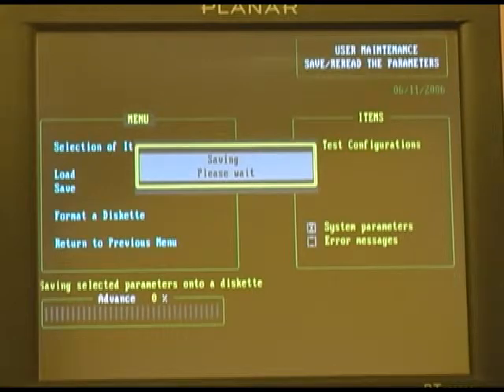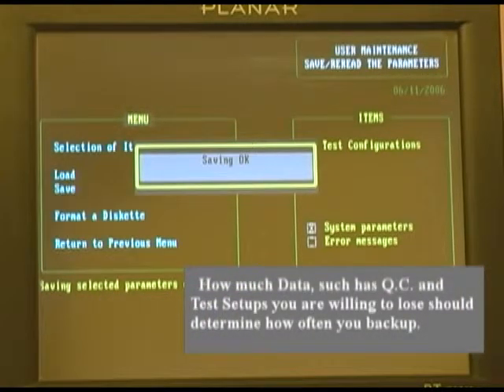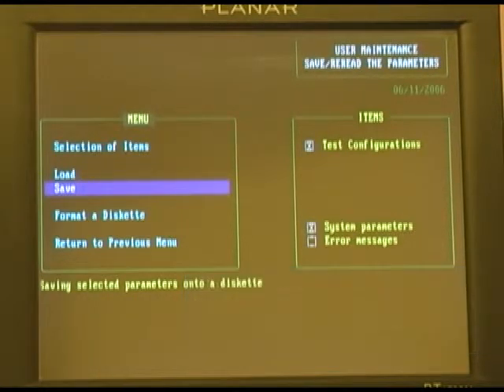We'll now take that information and save it onto your backup disk. This will take a minute or two to complete, depending on the amount of data that you're saving at the time. The importance of doing this procedure is highlighted in the event that you ever have a hardware failure, such as a hard disk drive failure. We can always recover your system and get you back up and running with a minimal amount of impact on you if you take the few minutes to save this regularly. It can't be stressed often enough that this is critical to your recovery in the event of a hardware failure with your CPU. Once you've completed this, remove your disk, and you're good to go for another week.